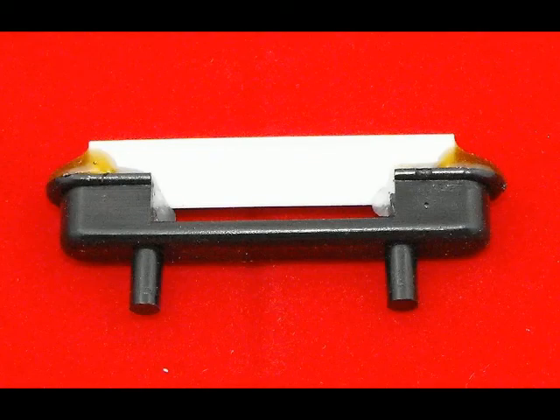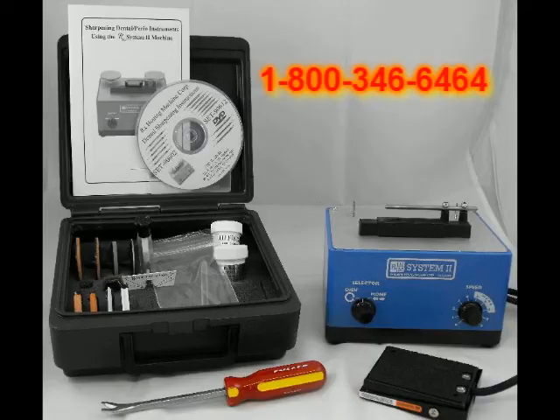Last but definitely not least is the U-shaped hone. We use this hone to round off the edge of the curettes, but also to keep them sharp. If you are missing any of the tools that I have described so far, please contact us at the 800 number listed on the screen. We will help you in any way we can in obtaining these tools.